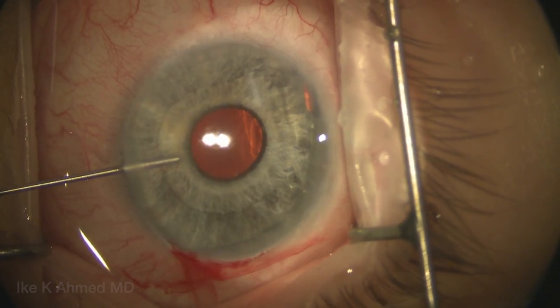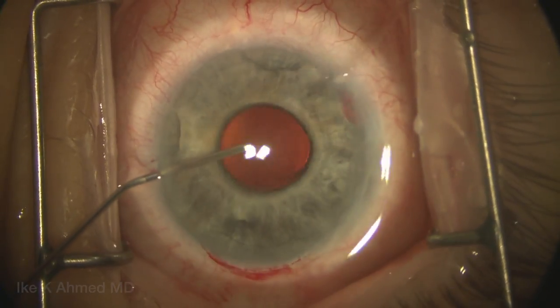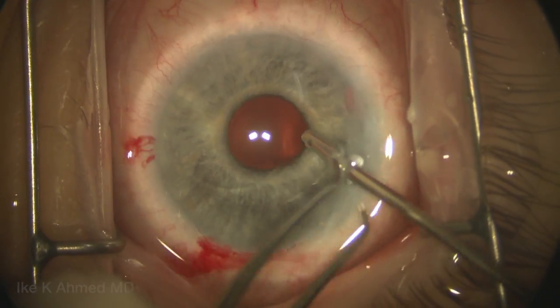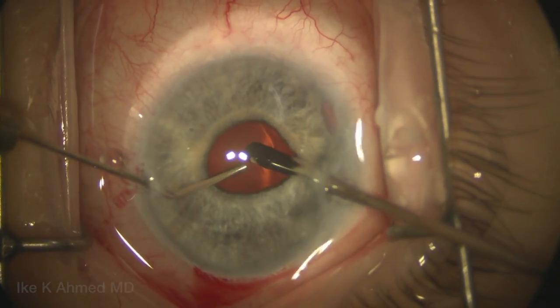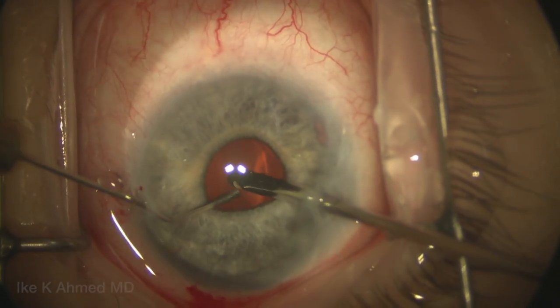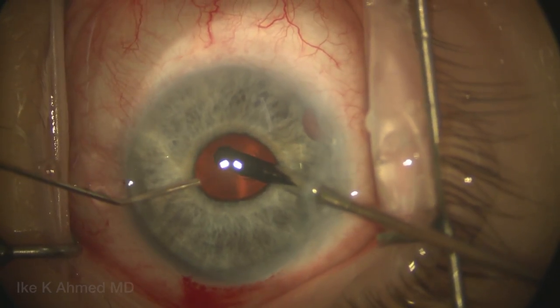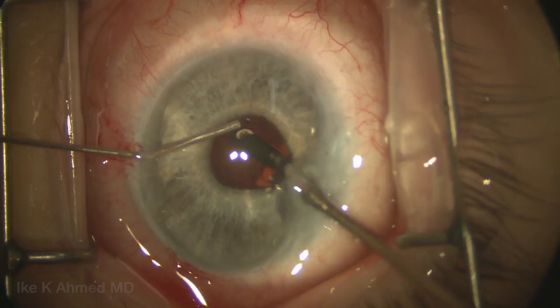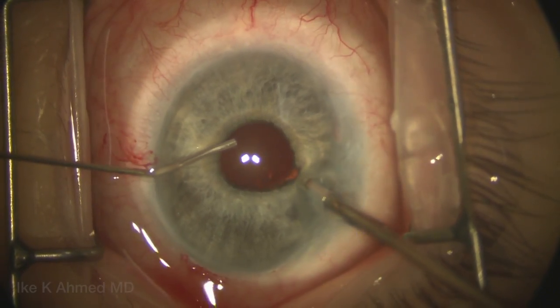In some cases, vitrectomy is not required. In some cases, an anterior vitrectomy may be required with irrigation. In this case, we're simply going to place the cutter through the pupil and just assess for any vitreous, injecting a little bit of BSS to create some turbulence, and doing a very limited vitrectomy — although really this is just to be on the safe side. This patient really didn't have any vitreous anteriorly. However, it is important to remove any vitreous prior to proceeding.